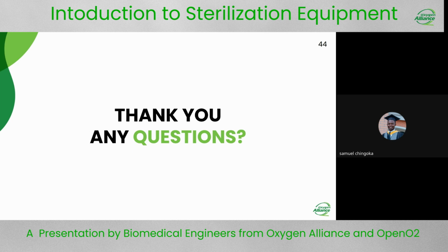All right. Thank you, Good Luck. That's a good question. Of course, as has already been said by our host, most of these will be covered in detail in different webinars. But this one, I can take it. There are a lot of factors which make us not achieve steam. So apart from power, we know that for steam to be generated, we have the heating elements in the steam generator. So chances are high that we have faulty elements. That's why we cannot produce steam. So that may be one of the reasons.